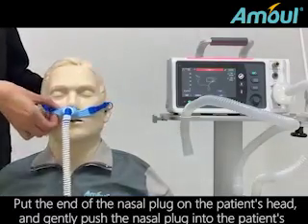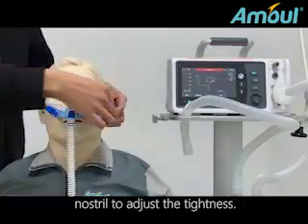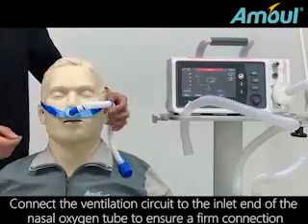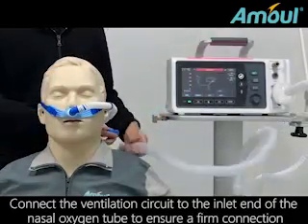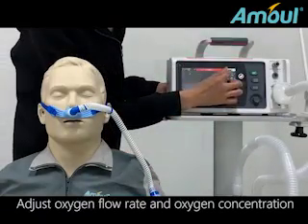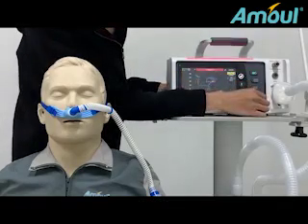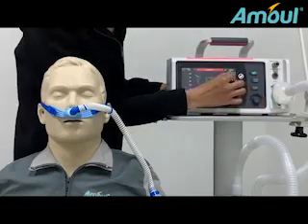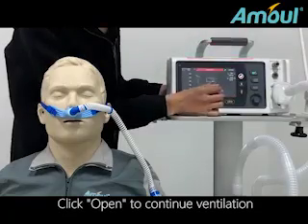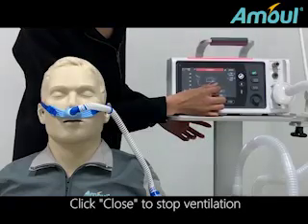Put the end of the nasal plug on the patient's head and gently push the nasal plug into the patient's nostril to adjust the tightness. Connect the ventilation circuit to the inlet end of the nasal oxygen tube to ensure a firm connection. Adjust oxygen flow rate and oxygen concentration. Click Open to continue ventilation. Click Close to stop ventilation.